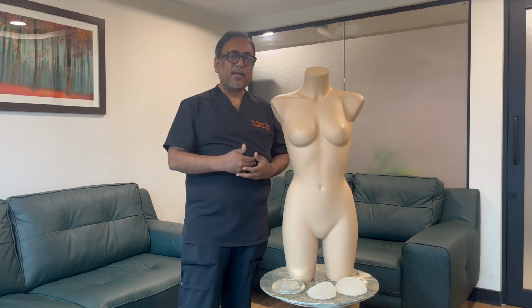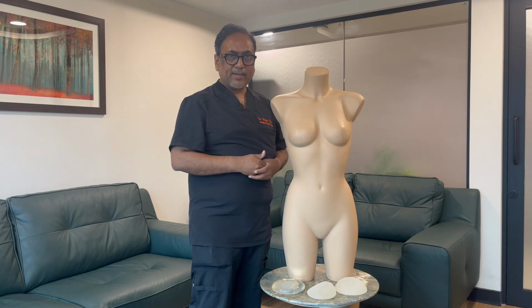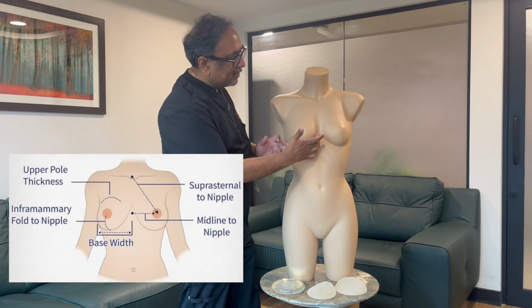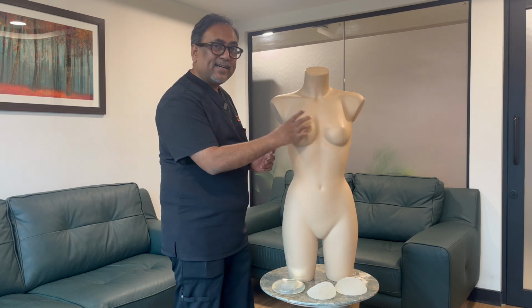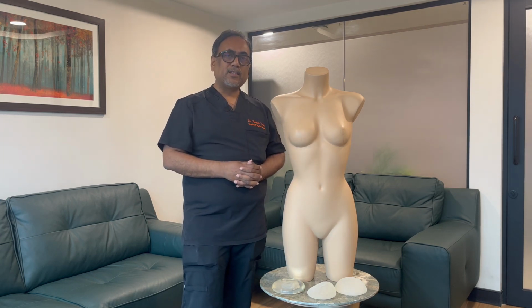Now in examination, there are many parameters which we take into consideration. The single most important measurement is the base width. That is nothing but the width of the chest at the level of the nipple areolar complex. We take the base width, and it is this base width which determines what the volume of the implant is going to be.